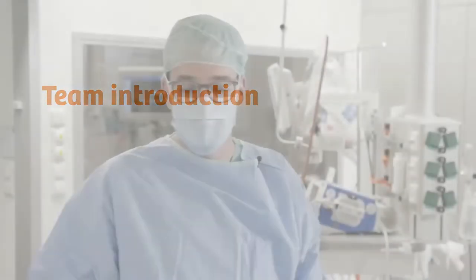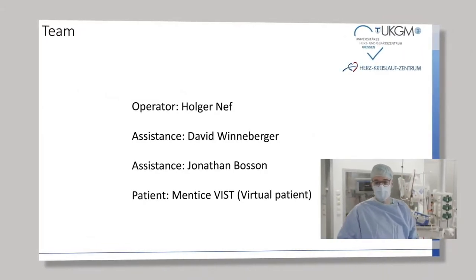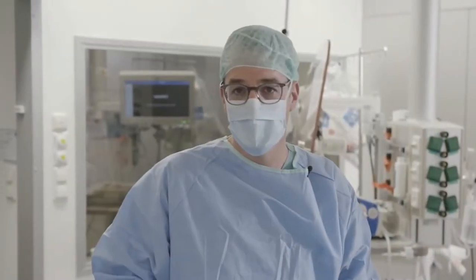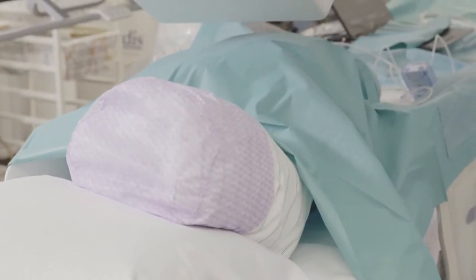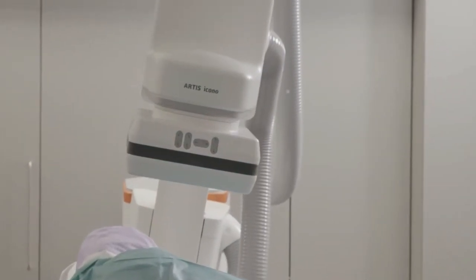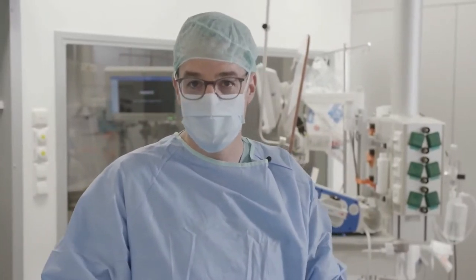And now I want to present you the team today. Of course, the hemodynamic assessment is done by David, and I have help here at the table, which is done by Jonathan. The special thing today is that we do not have a real patient; we have the Mentice VIST simulator here, which is only present as a virtual patient. However, we have the possibility to feel like in a real environment. We can steer our C-arm like in the real world, and the table is connected with our simulator so that we always feel like in the real cath lab scenario.